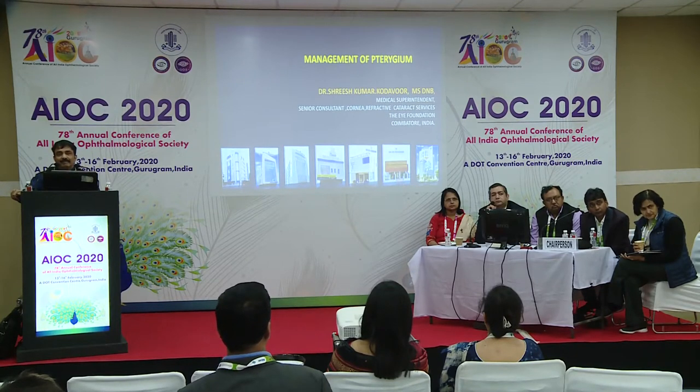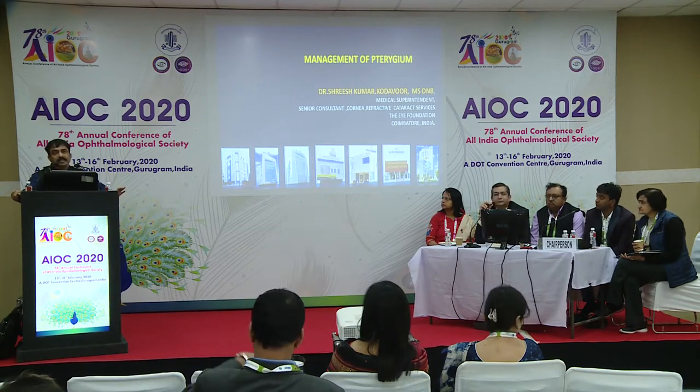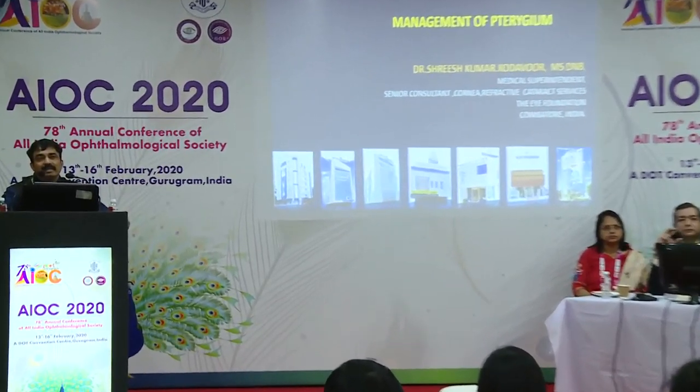Something similar to what we do in DMEK, but how do you reverse it, sir, if it is a thick graft in the anterior chamber? You have to do it with irrigation, so you irrigate one end and you put a strong irrigation, and it flips. I'll try to flip it, but then you always lose some cells. Yeah, in that process we lose some cells.